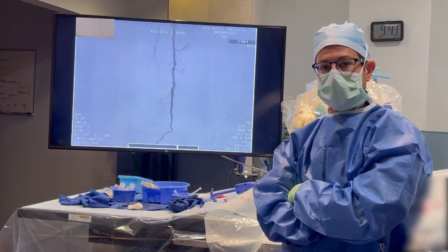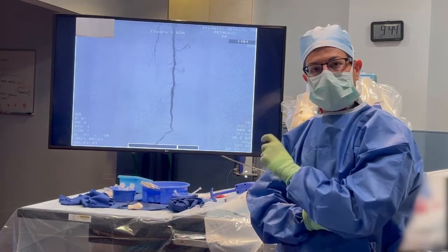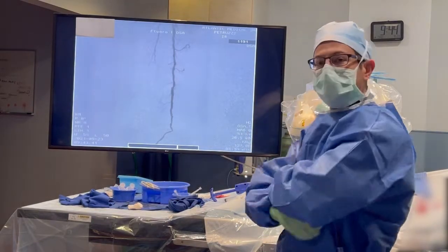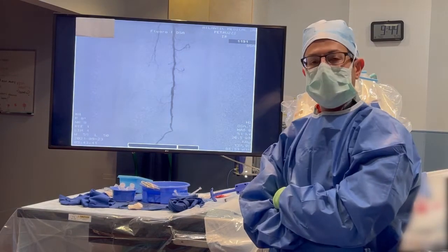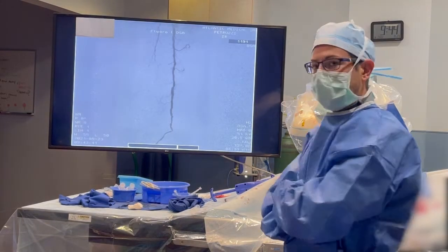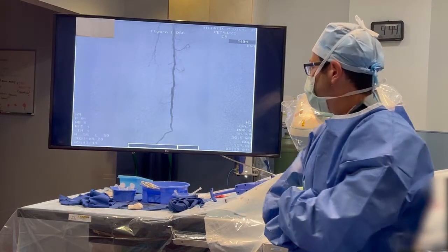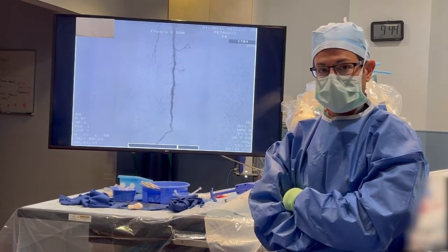and if you can appreciate it or you want to look back, you can see that that previous blockage and narrowing where there was not black x-ray dye showing is now open and flowing intact down the foot. So this is a major change to blood flow to the foot and to the calf, and now we still have that other blockage in the front of the leg that we're going to continue to work and open as well. But we've already made a significant improvement with this one artery alone to the flow to his foot. So we'll check back in after that.